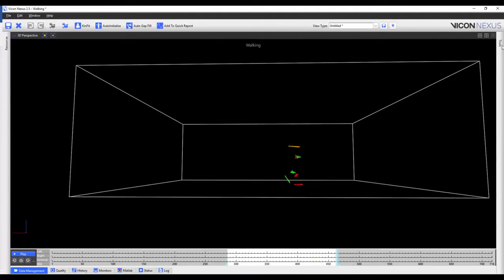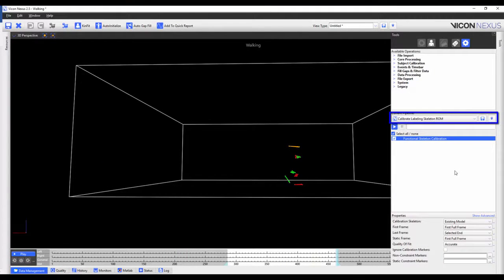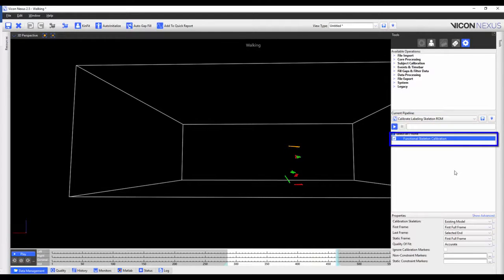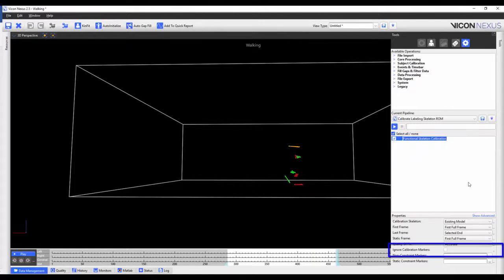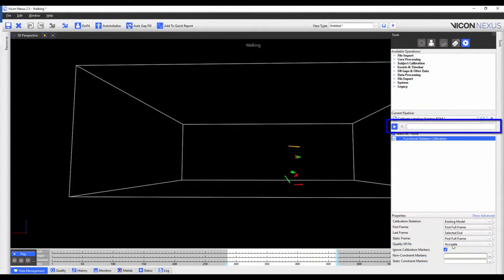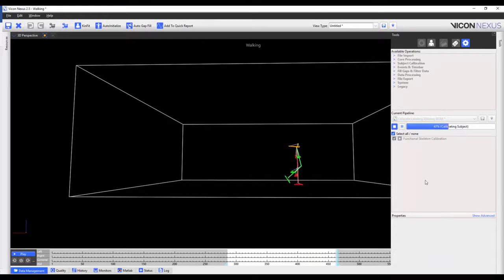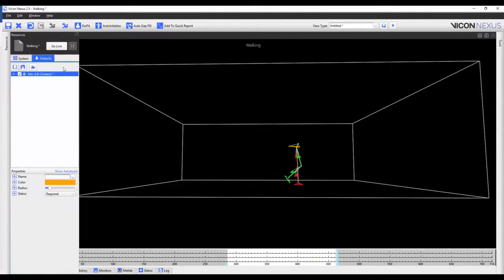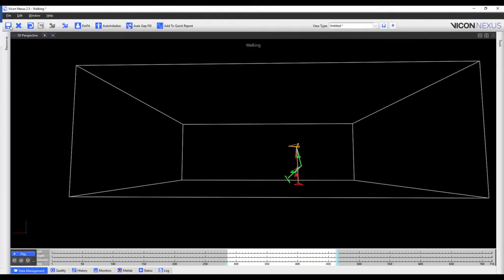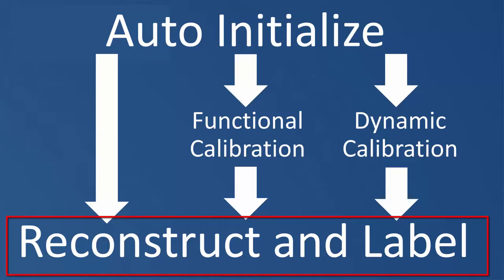Once this has been completed, I will again load the Calibrate Labeling Skeleton ROM pipeline operation, highlight Functional Skeleton Calibration in the current pipeline, and then check Ignore Calibration Markers in the properties, and run the operation. Once this has been completed, I will save the subject and save the trial. I can now continue to reconstruct and label the rest of my dynamic trials, which is what I'm going to be showing you in the next step.